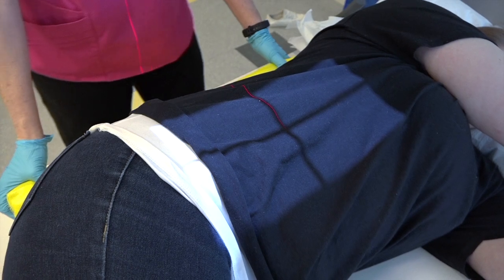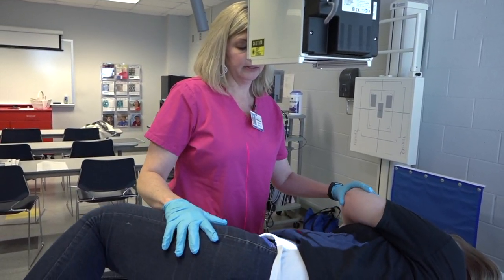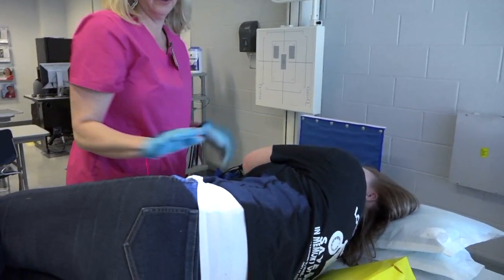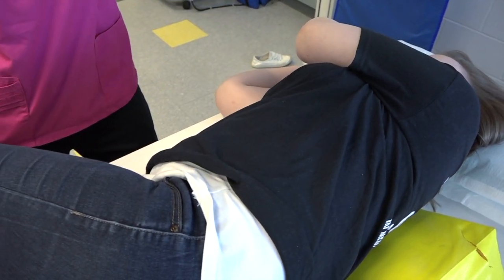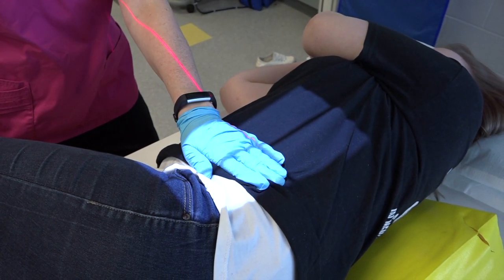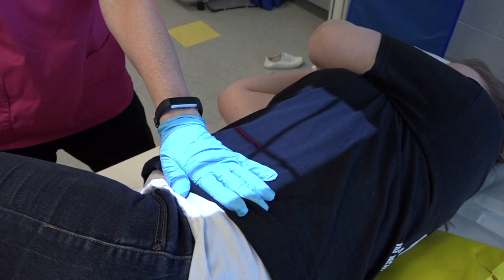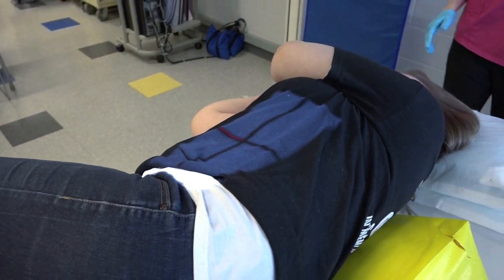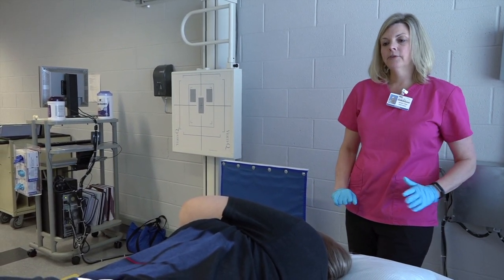Okay, so now we're going to roll over to the other side. Roll over to the right side, put our sponge behind our patient, ask them to lean back. We'll bring their arms over. There we go. So 1.5 inches above the crest. Sometimes they move just a little bit, so we want to make sure we have the right centering on both obliques. Okay, turn your head, there we go. If we look at the head of the patient, make sure they're lined up with the ear.